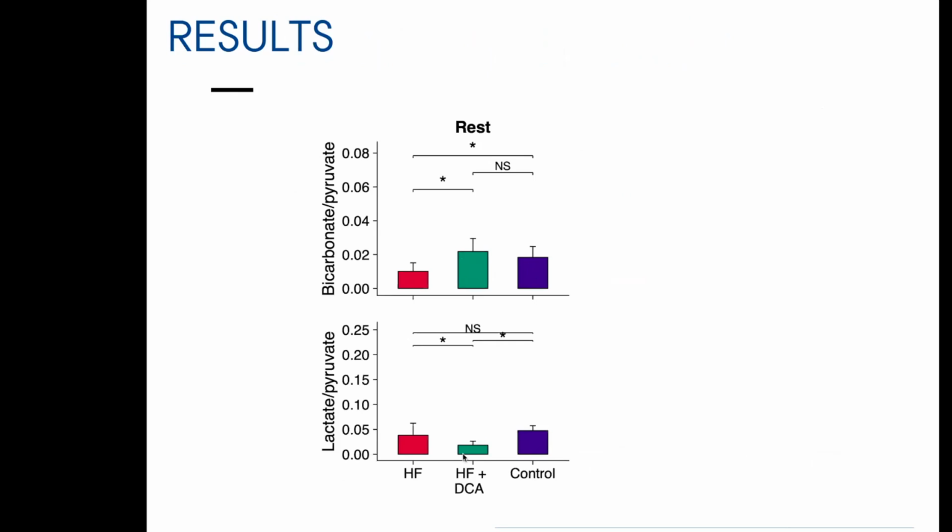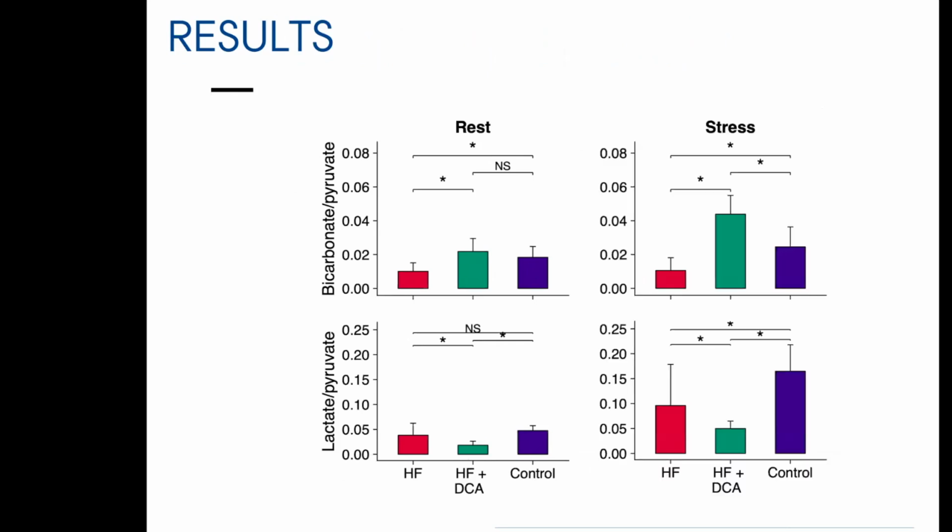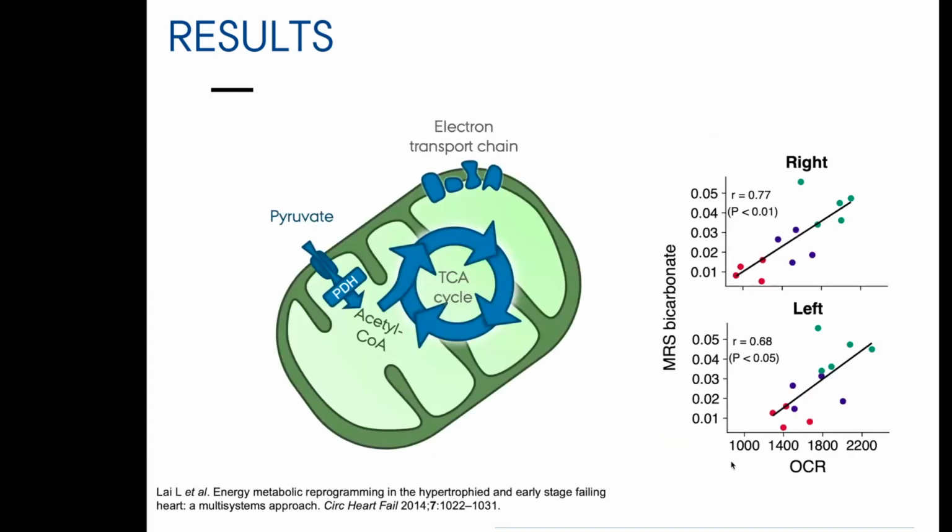So it sort of changes metabolism, and it's really under stress situation. That was what I was talking about earlier. If we then stress the heart, what happens then? Well, this is exacerbated. You see this dramatic increase in the capacity to drive things into the PDH enzyme here, and that is at the expense of the lactate signal, or the lactate pool.